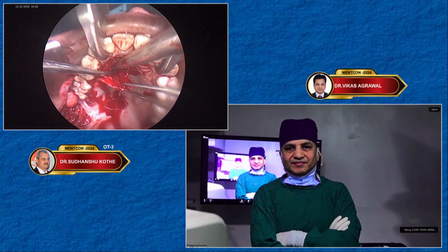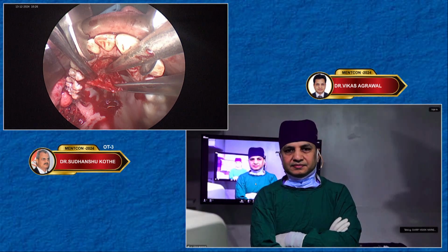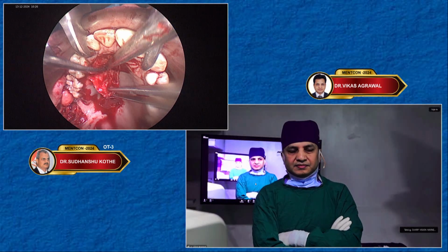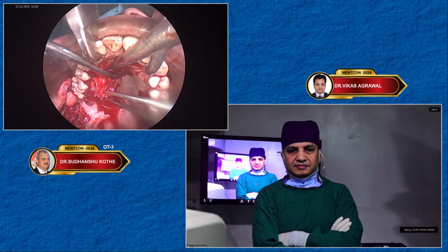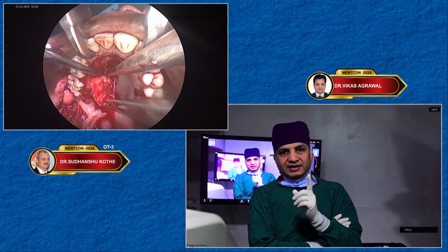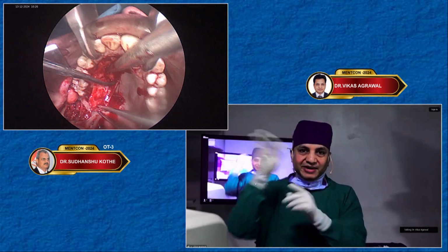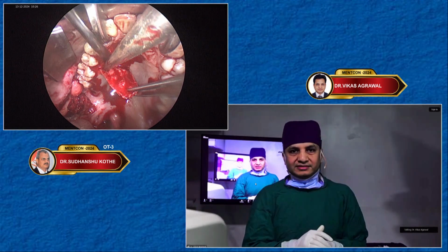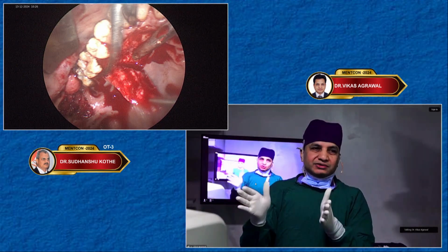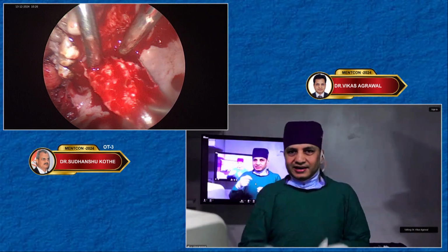Sir, one more question. What is your observation for the recurrence in cases done by coblation and cases done by the debrider? No, it is not the tool. It is the hand behind the tool and the brain behind the hand which is more important. From 2001 to 2008, we were doing debrider adenoidectomy only.